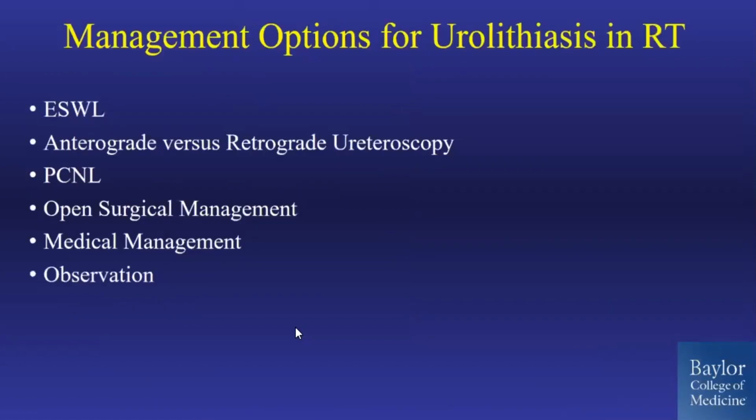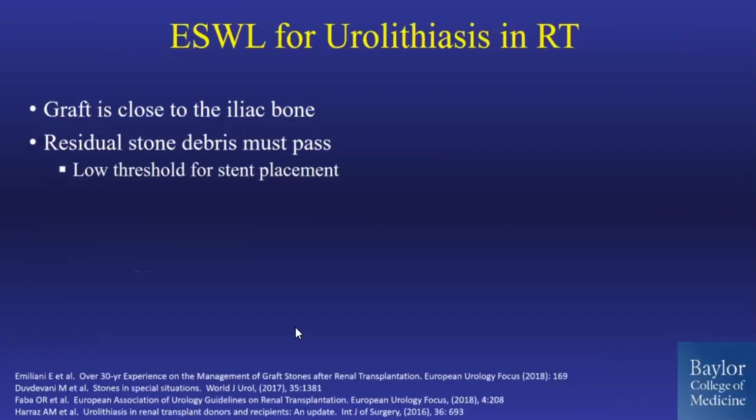In terms of management options, you have the full gamut of options for treating stones in the transplant patient. And we'll just go through each of them and some of the considerations in the transplant patient. So for shockwave lithotripsy, it's doable, but remember the kidney is shielded posteriorly by the iliac bone. So you need to shock them either prone or with the bellows. If you have a machine that can shock anteriorly, then that would be a reasonable option. But realize that you're leaving the patient with debris that needs to pass in a solitary system. And that can be precarious. So they need close follow-up, and you might even consider leaving a stent.